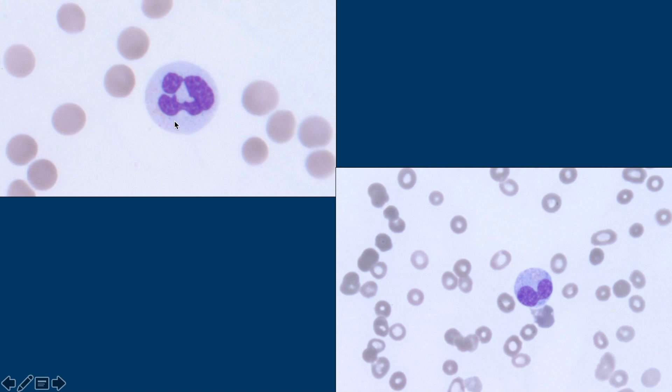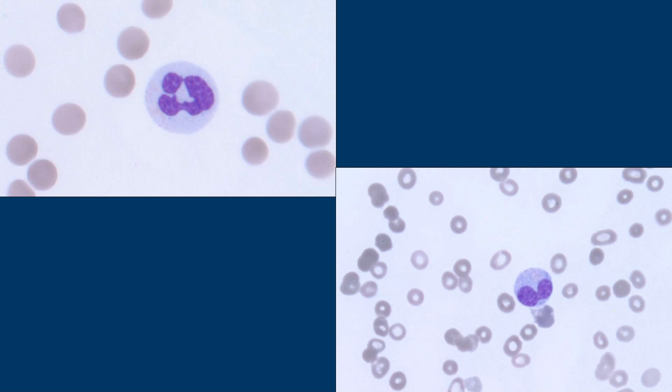This is hypogranular. So instead of having that prominent granulation that we saw, it's lost all of them. And that's a dyspoietic feature. Dyspoietic means potentially myelodysplastic syndrome — not necessarily, but that's one time where you could get dyspoiesis. It just means that it's an abnormality.